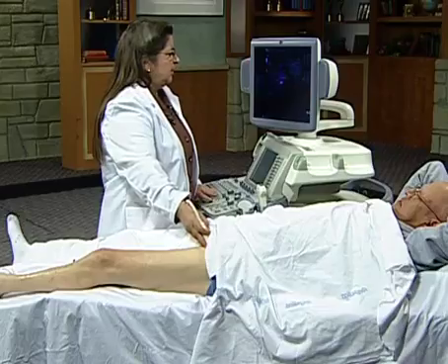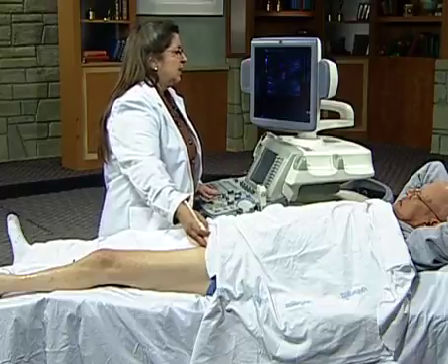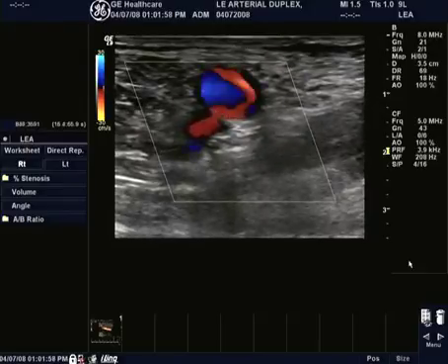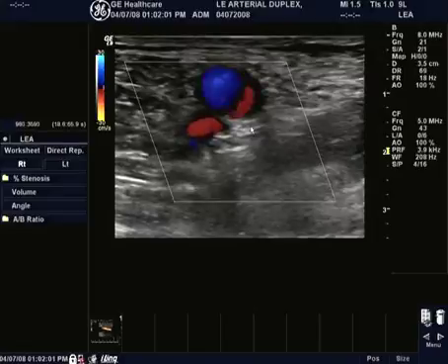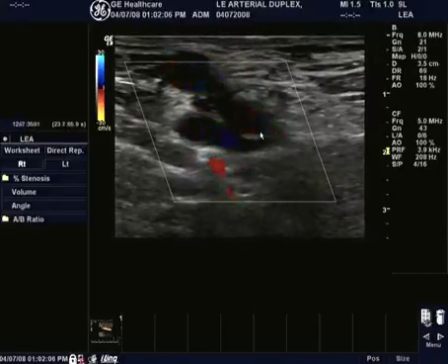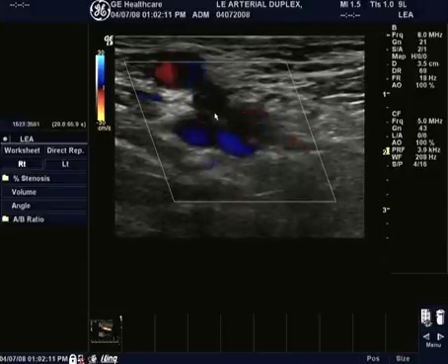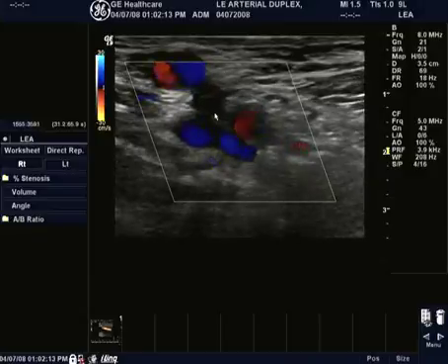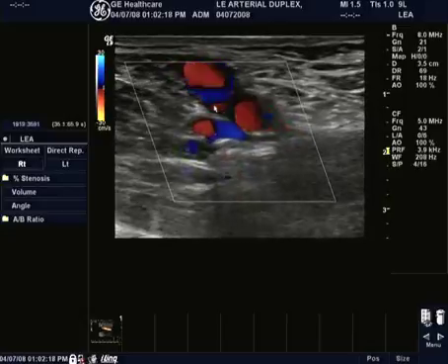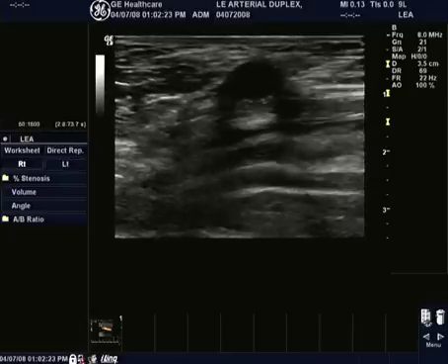Okay. Now, I'm just doing this for orienting myself. Obviously, we know we want to scan color with a sagittal approach, but we can get an idea of what's going on. Vein here, artery here, coming through the anastomosis, all right? And this is now the profunda femoral artery right here, and this is the occluded superficial femoral artery. That was probably the reason why the patient needed the bypass in the first place. So let's just go back to grayscale for a second and orient ourselves.